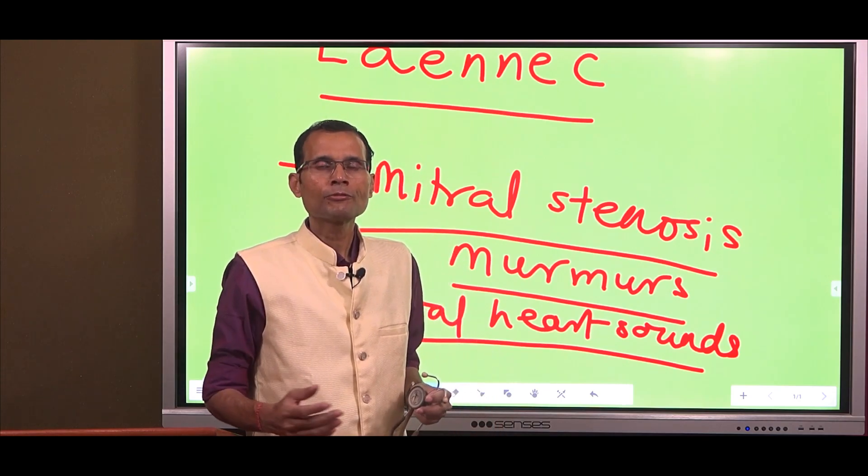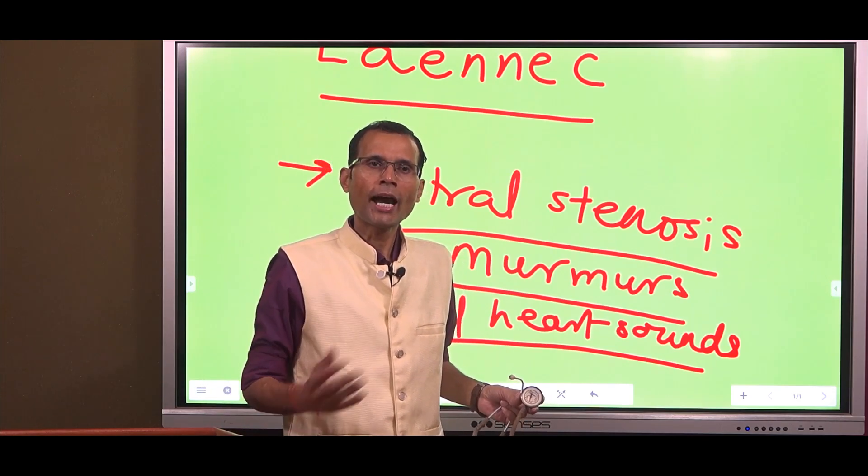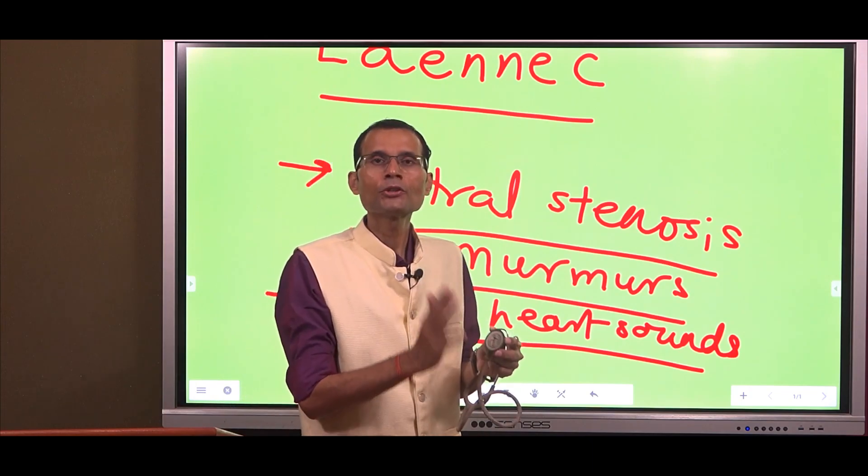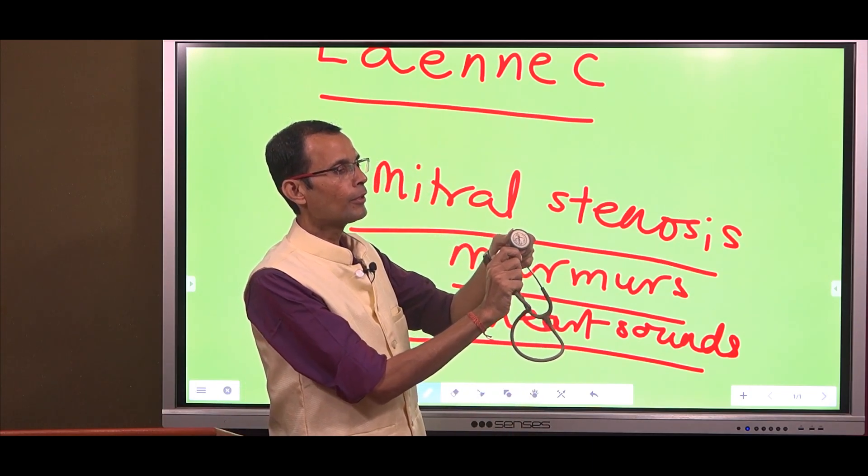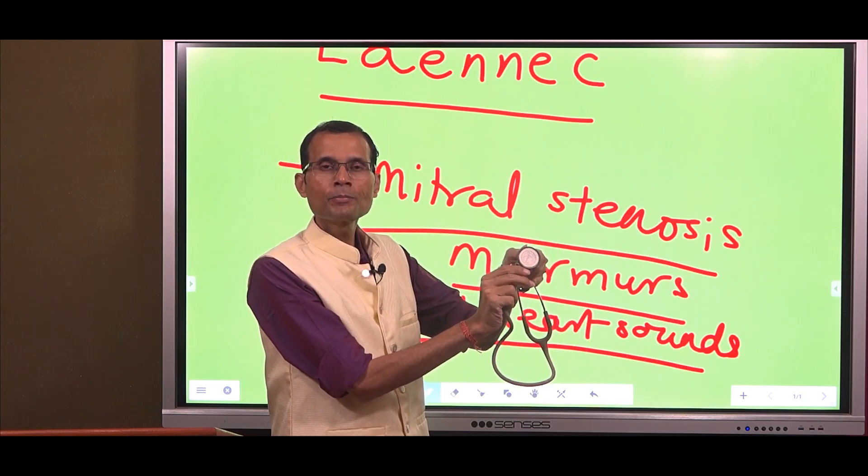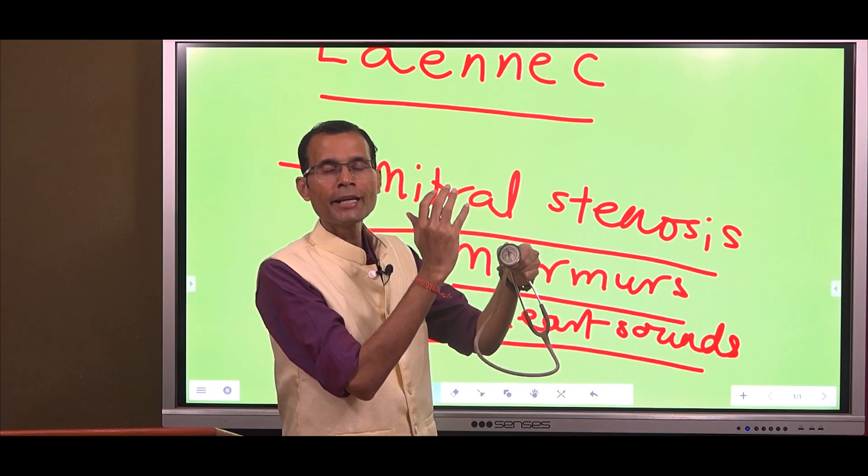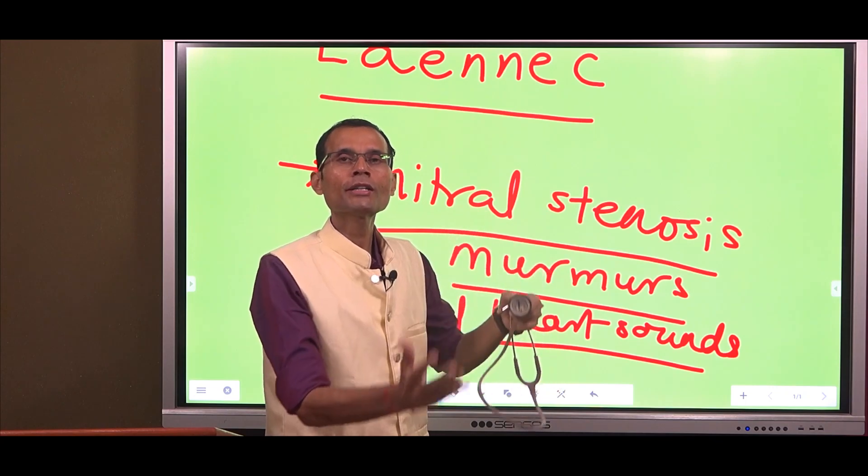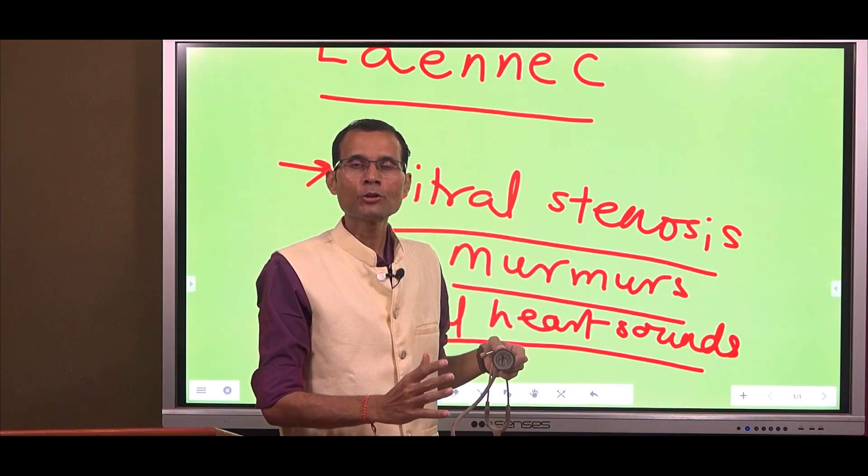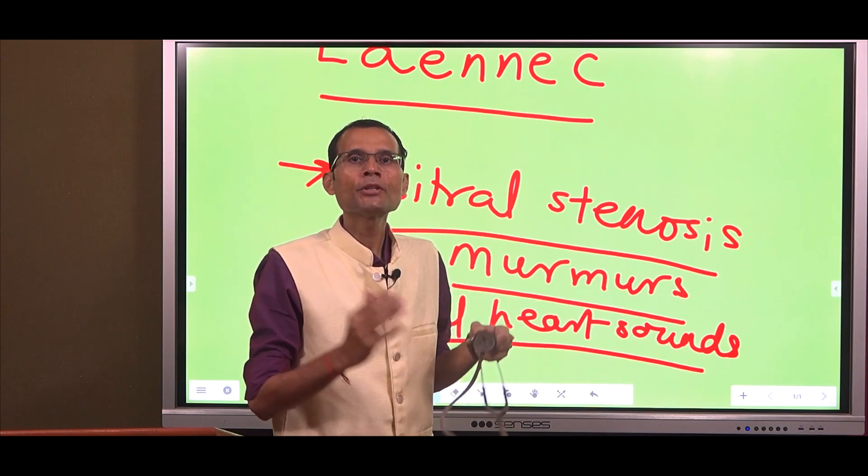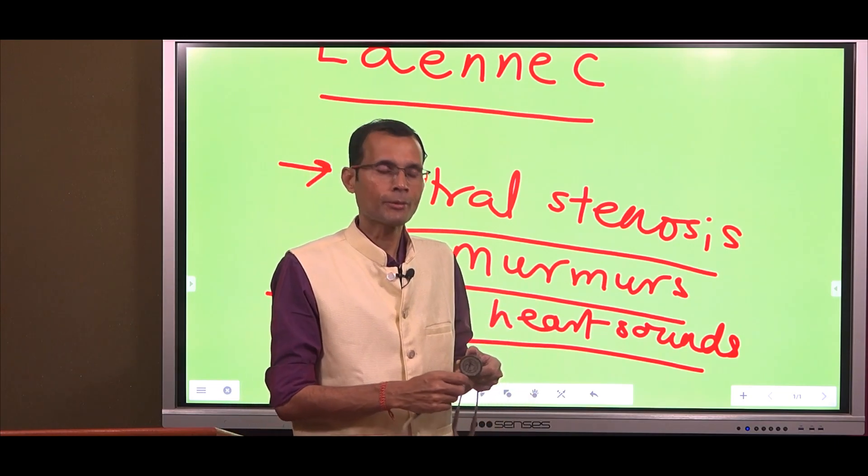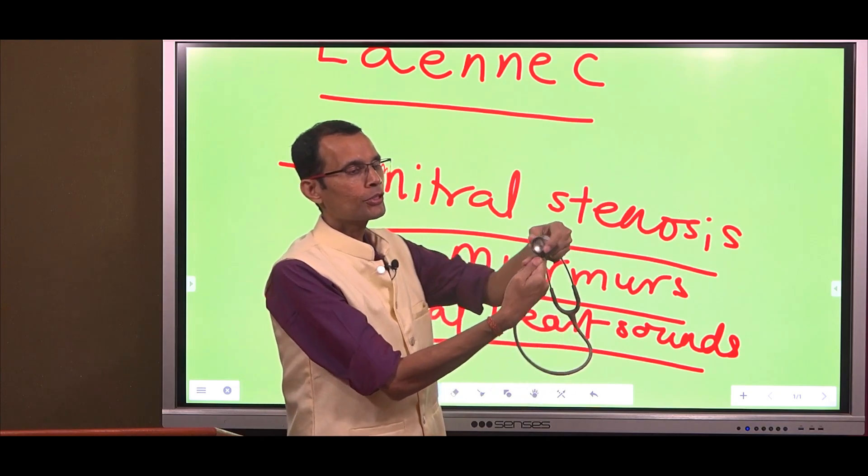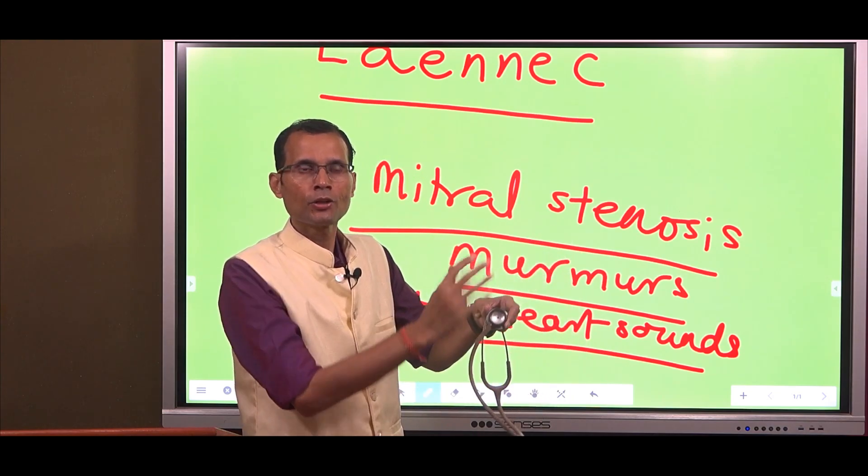Apart from that, for most other chest sounds and other sounds, we will use diaphragm. You can see there is a mechanism, a knob which you can rotate to connect either the bell or the diaphragm into effect. Both sides cannot be used simultaneously. You can either use bell or you can use diaphragm, and you use the knob for connecting either of them.